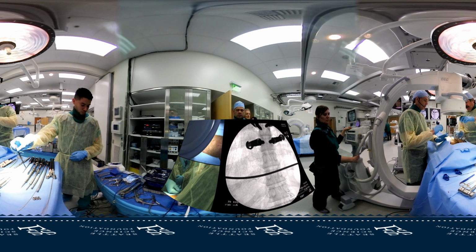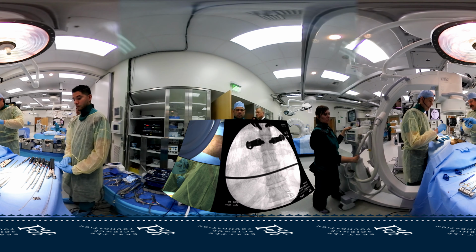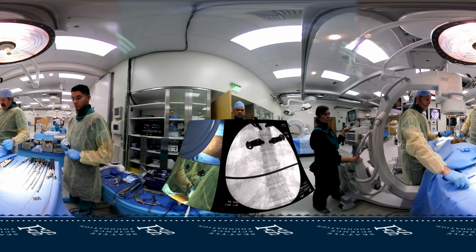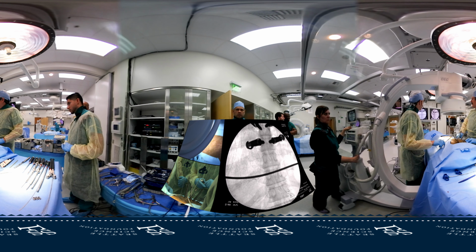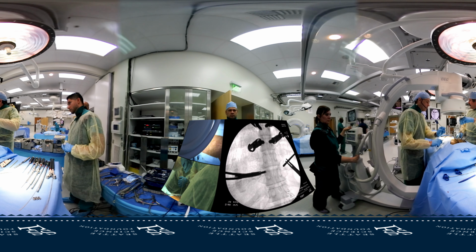These Jamshidis are long ones. I normally use a shorter one, but these will work. They're a little unwieldy. And I always try to keep my hands out of the radiation as much as possible. So I'll just go down, touch bone, and then take an AP. And this will get me in the ballpark, and I'll begin to make adjustments.